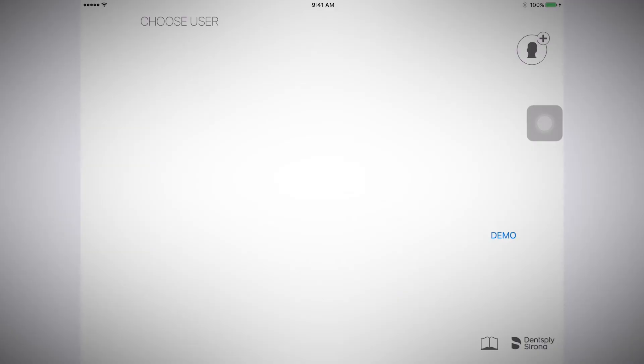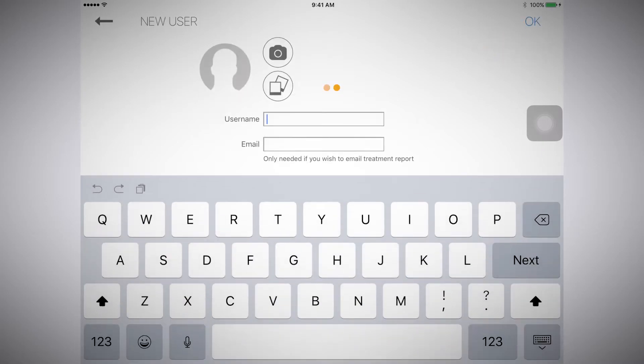To create a user, select the person icon with the plus button. Now, upload a photo and then type in your username.